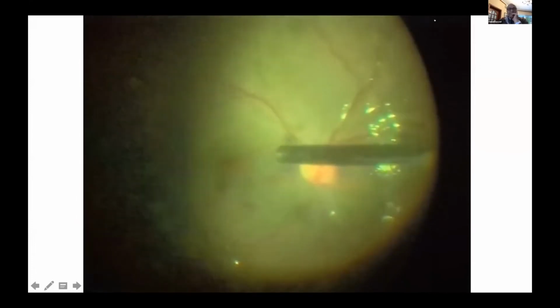And finally, I got the retina flat. I did direct exchange in these cases; I prefer to do direct exchange. And the retina is flat.